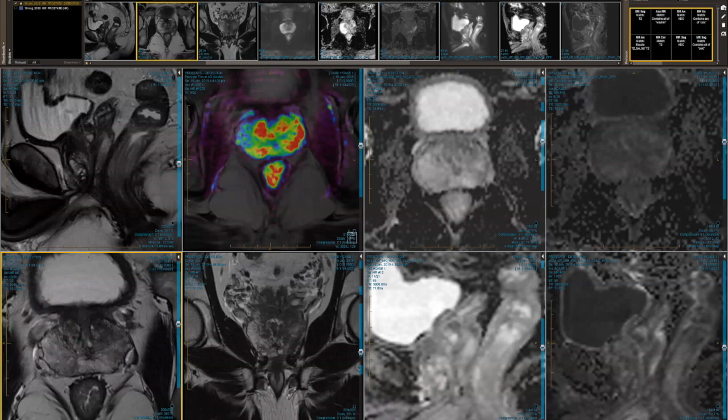All right, now the first one hopefully will be a fairly easy one. I think people might agree, just to get the ball rolling. So this patient was a 65-year-old man who presented with a slightly elevated PSA of 5.5. We repeated it as per usual about a month or so later, and it came back actually slightly lower at 4.6. And now the interesting thing, we routinely, when we're repeating a PSA, use the free to total PSA ratio, or almost routinely, certainly very commonly in our own practice.